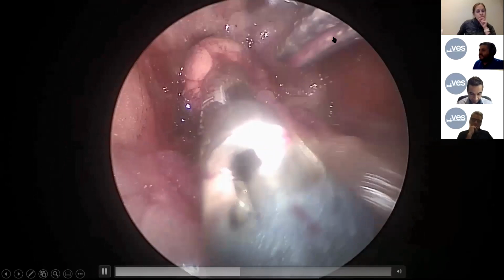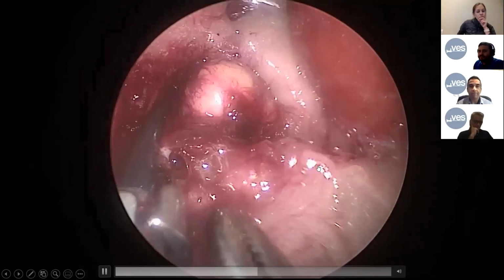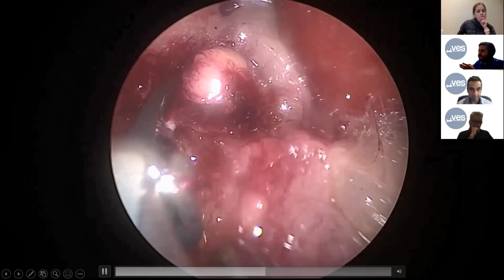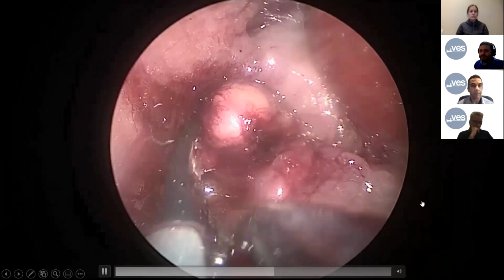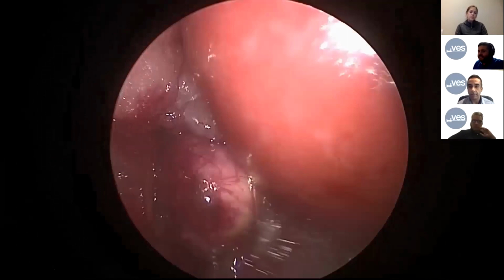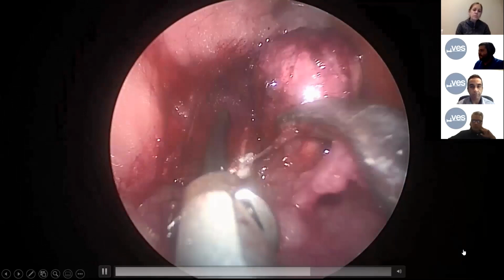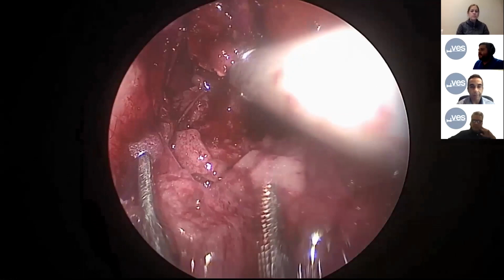You can see some dissection. The vena cava is not right below the gland. It's a couple of centimeters medially. So you don't have to worry so much about that. Renal artery and vein are easily distinguishable on the medial and caudal sector. It's very, very far away from the working space of the surgical field.